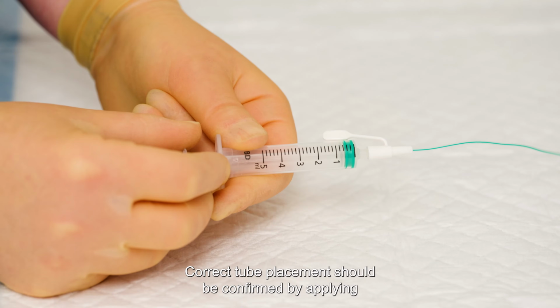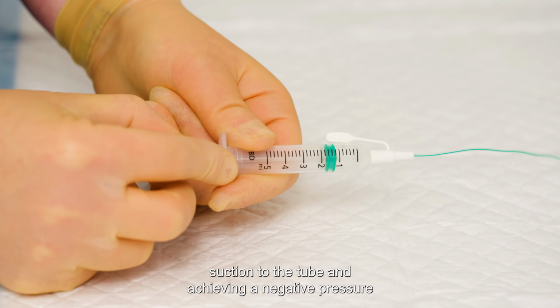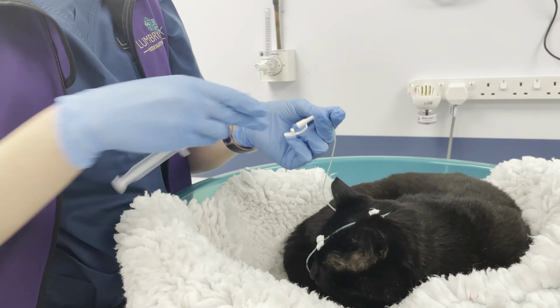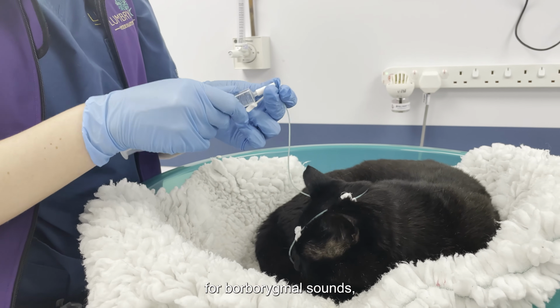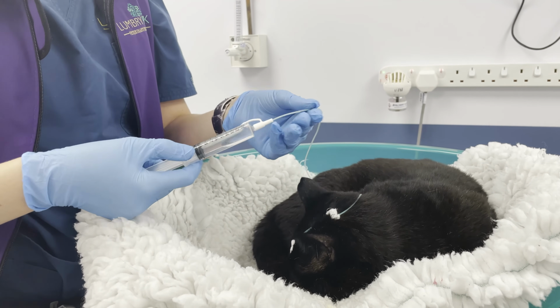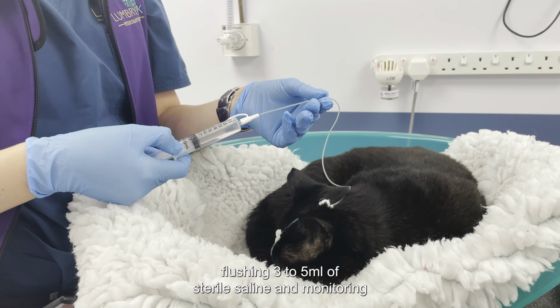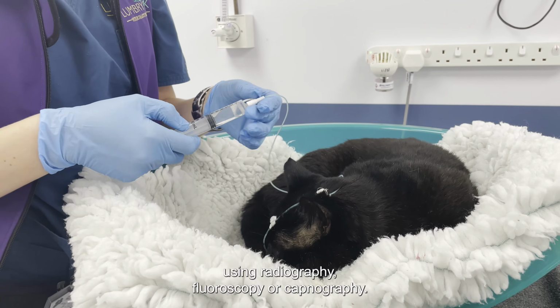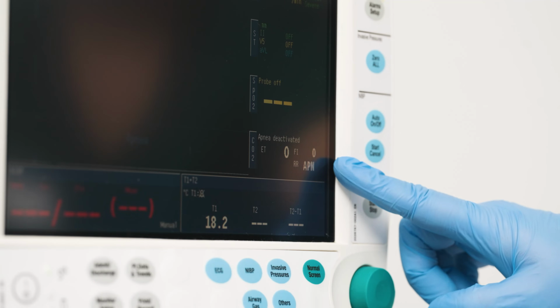Correct tube placement should be confirmed by applying suction to the tube and achieving a negative pressure for naso-oesophageal tubes, not nasogastric tubes. Instilling air and listening to the cranial abdomen for borborygmal sounds. Flushing 3 to 5 ml of sterile saline and monitoring for a cough, which would indicate incorrect placement. Or using radiography, fluoroscopy, or capnography.